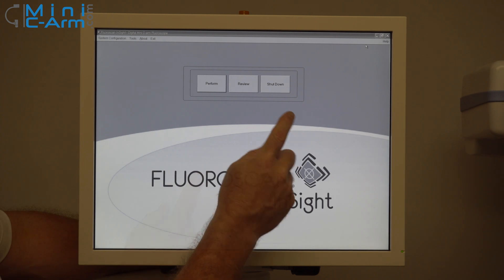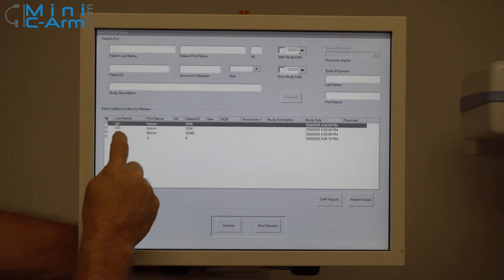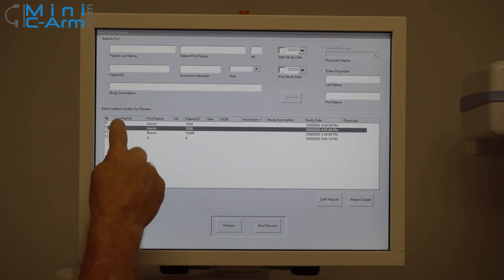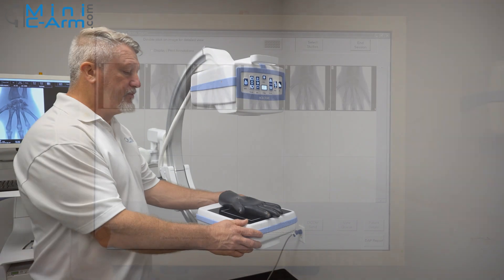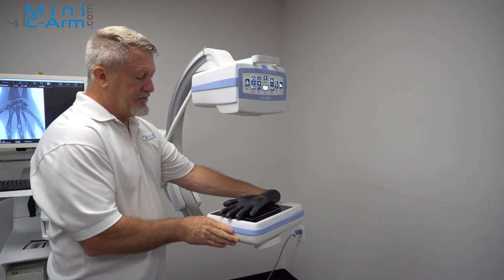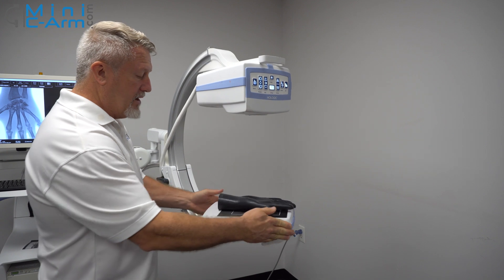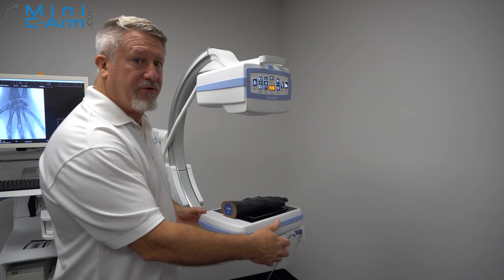When you want to review cases on the machine, just press review. You can actually choose a couple of different ones by hitting the shift button, select them, and review all the images at once. On this machine, you can rotate the flat detector 180 degrees, and there are indents so you actually feel it when you get to center and on both ends. The nice thing about this is you can do this while you're x-raying.